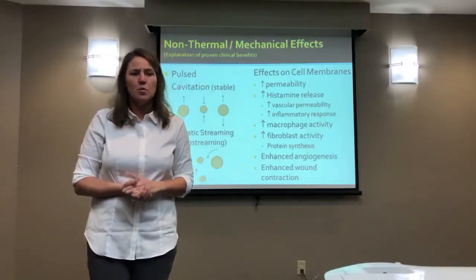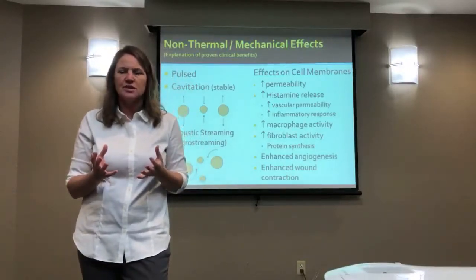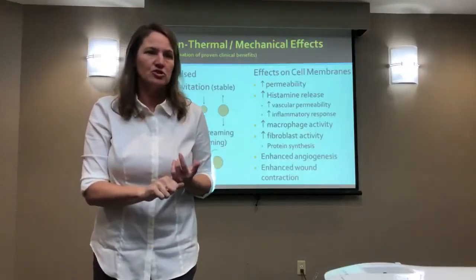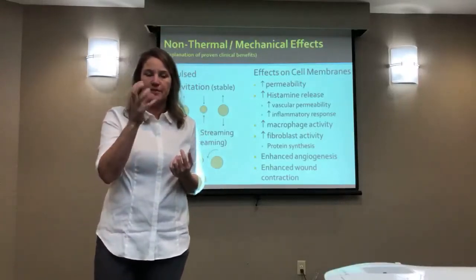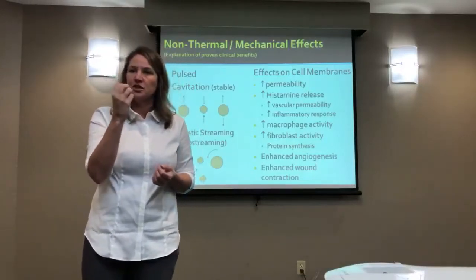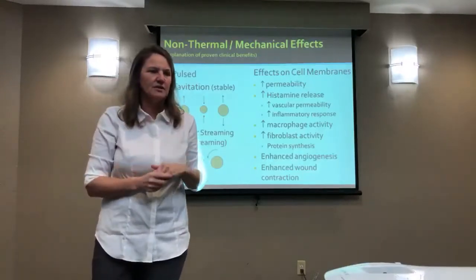So when they looked at why ultrasound works, the way I look at it is sort of this acoustic energy, this vibration is shaking up the cells. Some researchers credit it to cavitation, the gas buildup causing bubbles that vibrate, and that vibration at a level that's not high enough and frequent enough to heat it, but enough to just oscillate it and shake it.